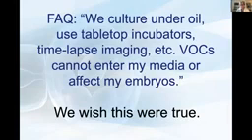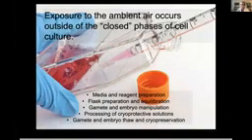Everyone strives to culture in a closed environment, if you will, under oil, using tabletop incubators and time-lapse imaging. Unfortunately, this is not going to completely deter VOCs from entering your culture media or impacting the embryos you're trying to culture. One reason is that as much as we strive to maintain a closed-phase environment of cell culture, many of the SOPs we have to use, whether it be flask preparation, media preparation, or preparing thawing agents during cryopreservation, are unfortunately still exposed to the ambient air.